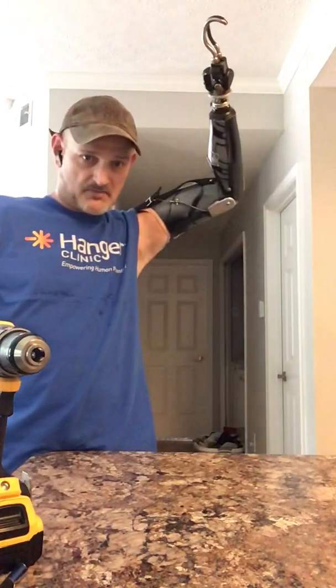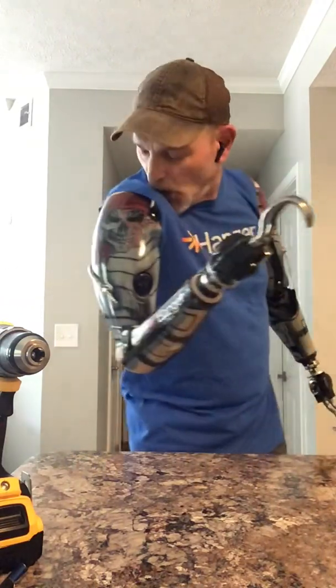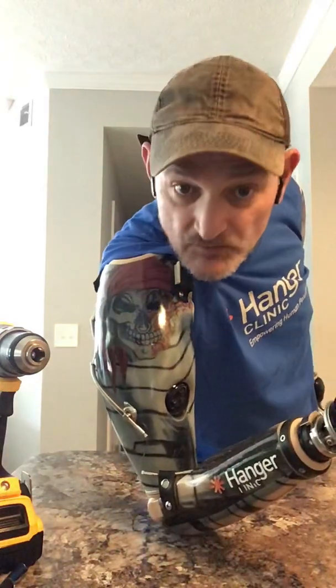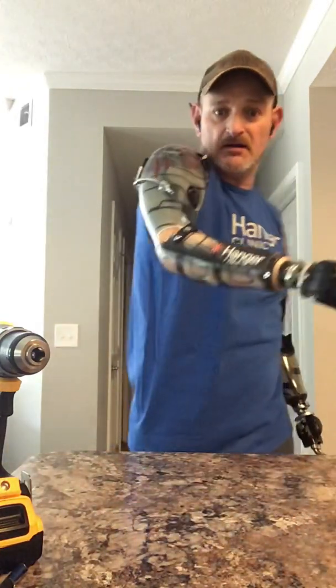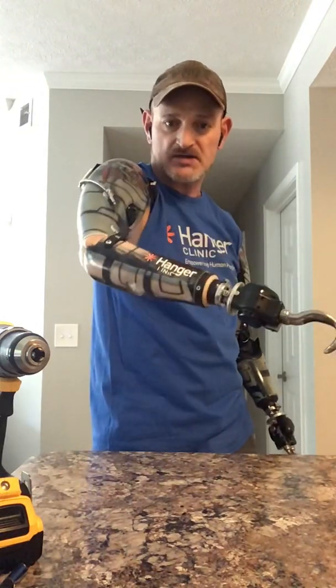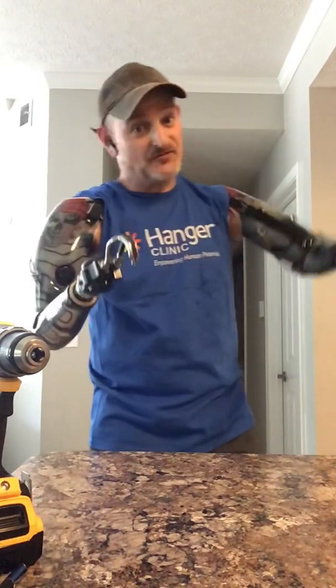Now the elbow — both arms are body-powered. On my left, I use my body to unlock. See that big silver piece on the elbow? That's a manual lock. All I do is shrug my shoulders — I can lock it, unlock it, lock it, and put the arm where I need it. On the right side over here, there's a little switch — a bump switch. All I do is hit it with my chin. It unlocks — it's got an electric elbow over here. Where this one's manual, this one's an electric elbow. I can move the forearm up and down any way I want. That's how they work — pretty easy for me after 13 years.